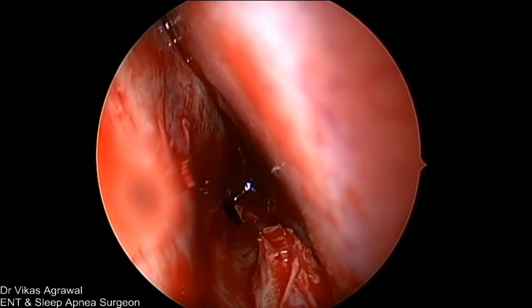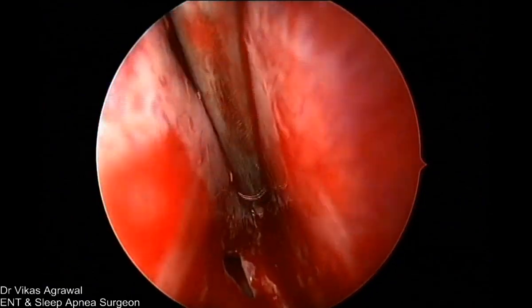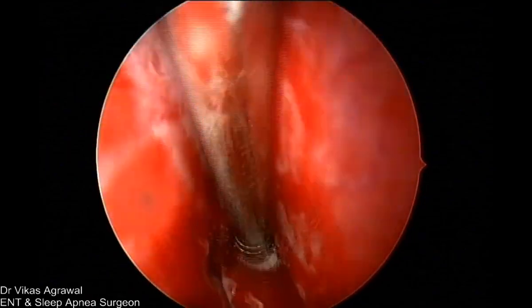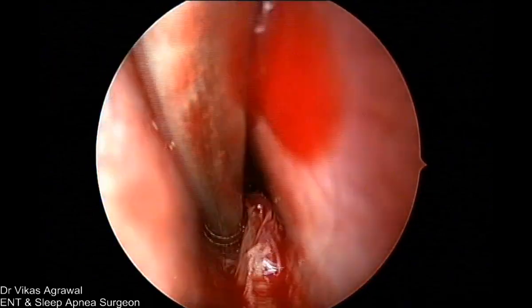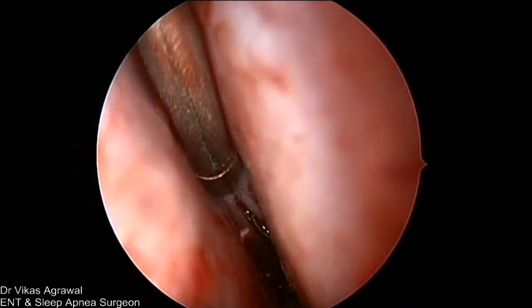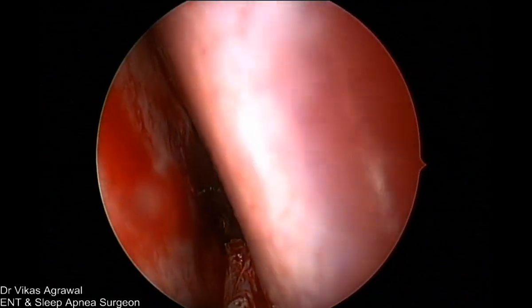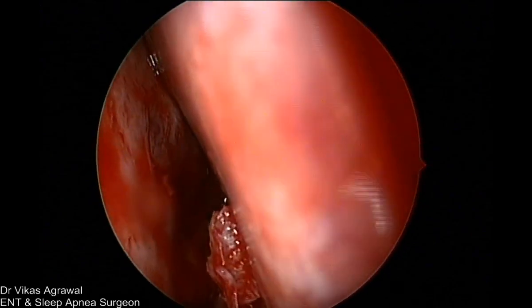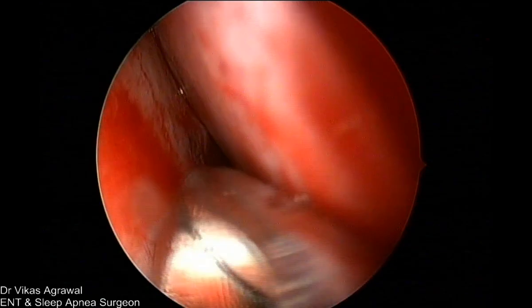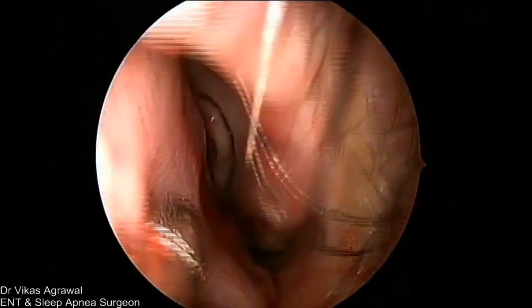Okay. So we have gone right till the back. Rostrum of the sphenoid is somewhere here. So we need not go and remove the rostrum in this case. If required, you can also remove the rostrum. Here in this case, it's not required. So I have done a complete septoplasty, only preserving the anterior part. And you have seen how much is the airway open. Can you leave that? Sure. Debrider ready, suction ready.